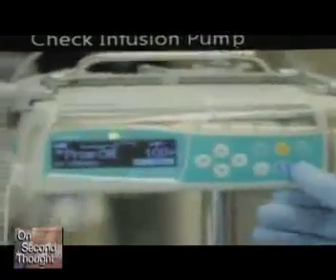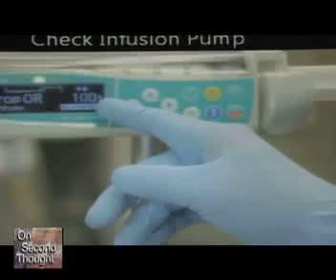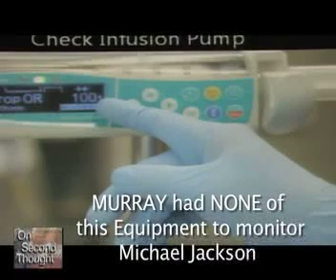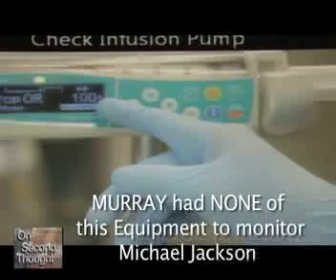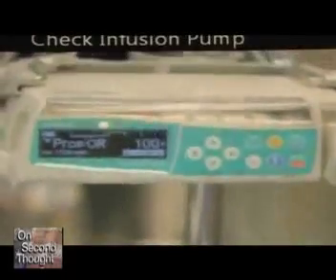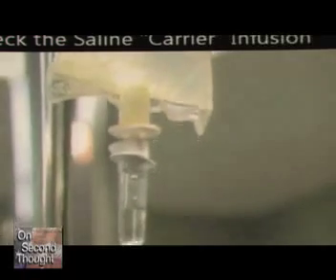You check the infusion pump. Please stop. You check the infusion pump because the patient's life depends on the infusion pump giving the amount of drug you specify. Again, you can't say, oh, there's a manufacturing error. The anesthesiologist owns this. They own responsibility for the rate of the infusion and to see that the pump is doing what it's supposed to do. So you check it constantly during the procedure. Please continue. Here he's checking that the pump is giving 100 micrograms per kilogram per minute, a reasonable dose for sedation, maybe a little bit high.